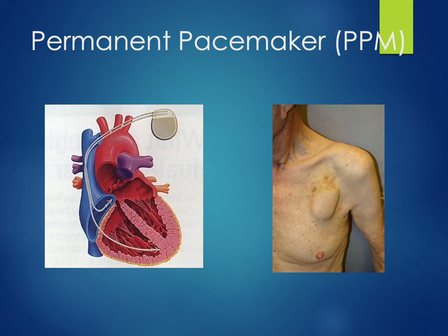So we've talked about emergency or temporary pacemakers where, let's say your patient's heart rate just suddenly drops to 20 and you grab the code car and you put the patches on them front and back and you start to pace them using the defibrillator. That would be more emergent, more temporary. However, sometimes these patients start to have more chronic problems that really aren't fixed with medication or anything else, and we need a more permanent fix, thus the permanent pacemaker.